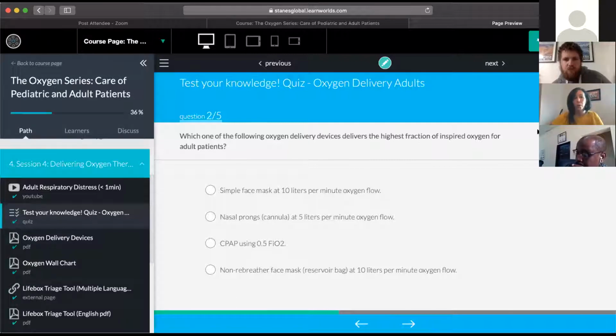Wonderful. So we will review the different oxygen devices. Most people are saying either CPAP at 50% FiO2.